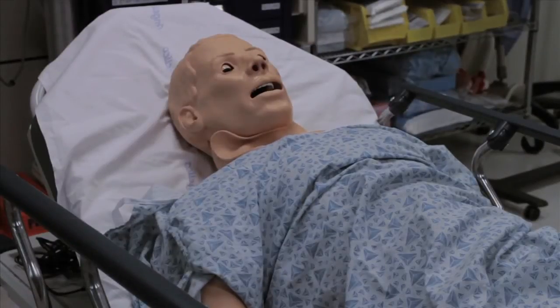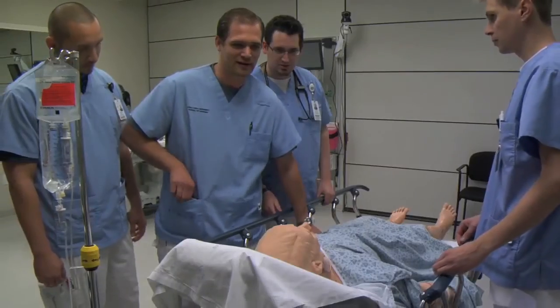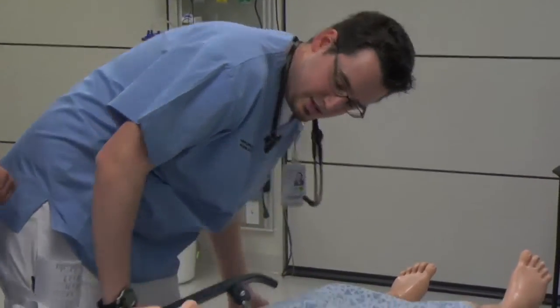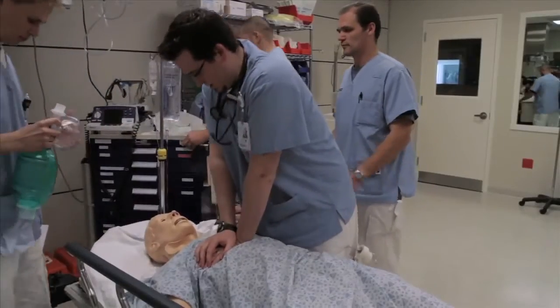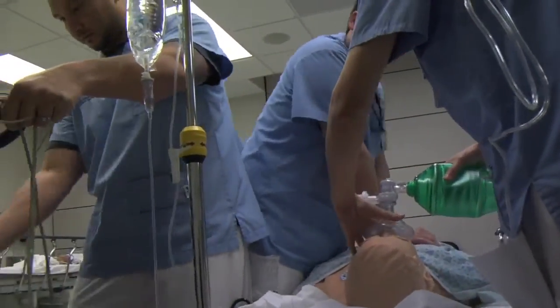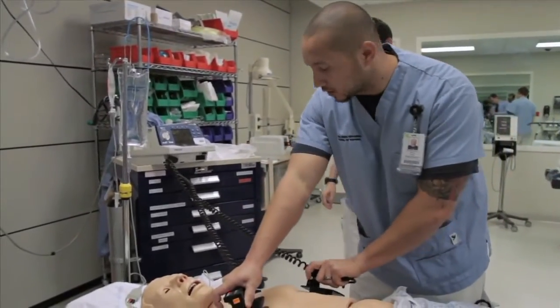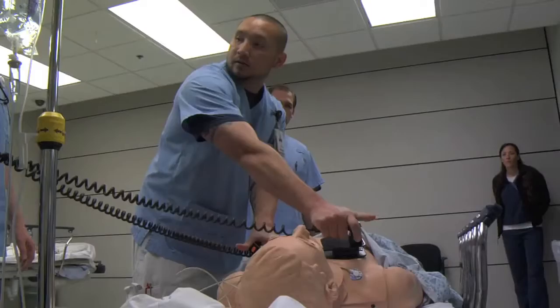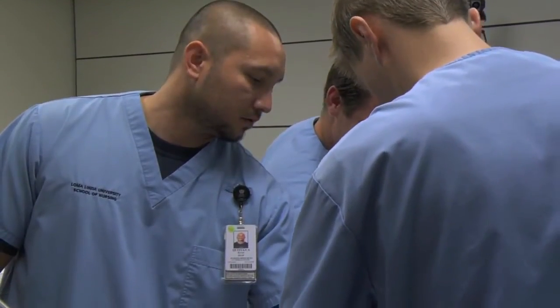Yeah, you take point, man. All right. Hey, Al, how you doing? How you doing, sir? Doing okay? Sir. Oh, the pulses are getting really slow. Bradycardic. Oh no. He dropped. All right, so this begins. BLS? You said okay. No pulse? Yeah, no pulse. You're doing CPR. 1 and 2 and 3 and 4 and 5 and 9 and 10. 12 and 13 and 14 and 15 and 16 and 17 and 18 and 19 and 20 and 21 and 22 and 23. Charge, please. Charging. I'm clear, you're clear, we're all clear. Clear. Shocking. Here we go. Okay, you're done, you saved him.